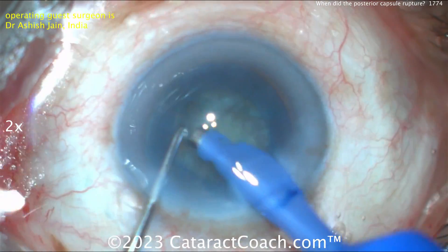Cleaning up anterior cortical material — you know it's going to be a big break, you tell me when. Buzzing in with the phaco probe, here comes the chopper — a combo chopper, vertical chop, beautifully done. Look at the chopper tip: not too long, it's a reasonable chopper that's not going to poke the capsule.